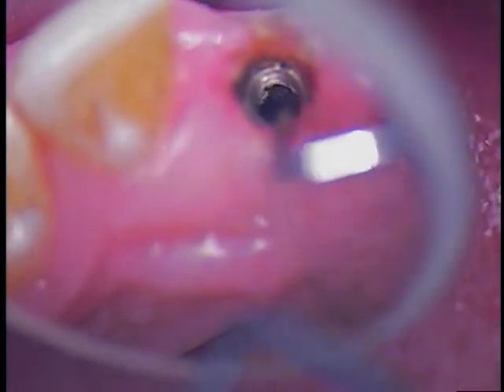And there's some black stuff in there. I need to go in there and get that with the explorer. Or we can send down a periodontal probe, which is a blunt end. Find out what that is. Oh, it's some kind of a sleeve or plastic material. Let's see what that is. Or is it soft tissue? Could be just soft tissue.